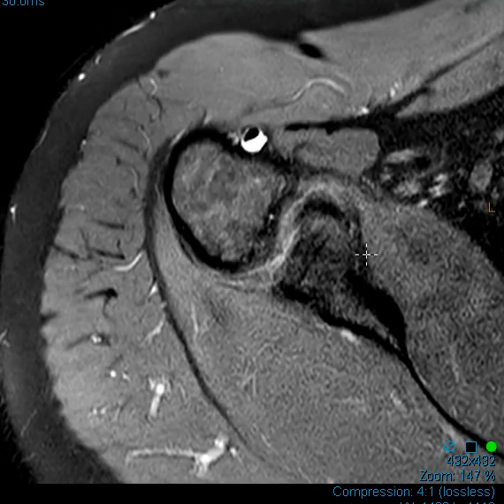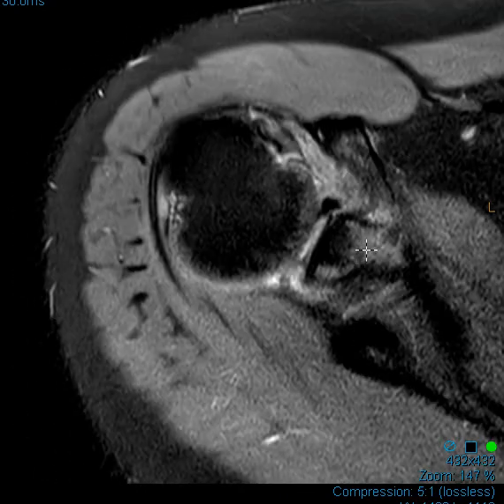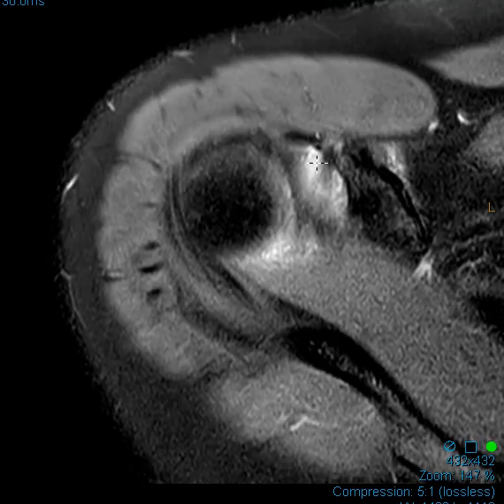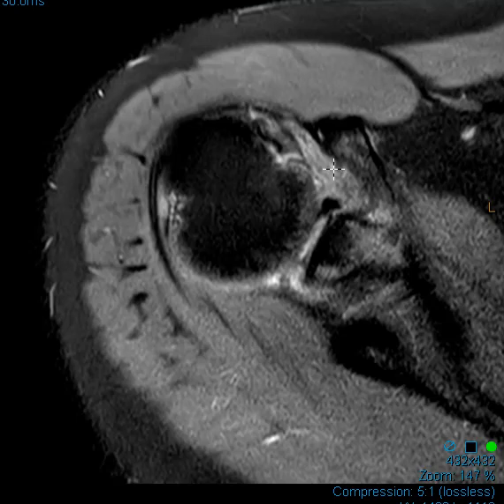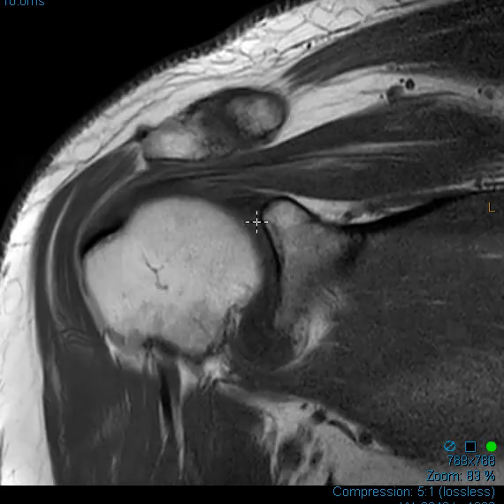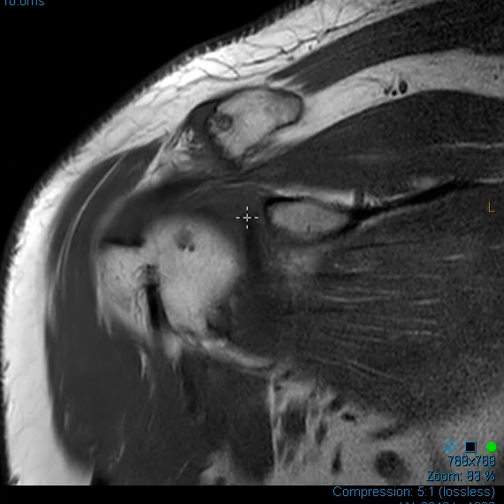The question is, how do we know he has adhesive capsulitis? If we roll up to this region, here's a coracoid process. There's a little area in here that sometimes will get inflammation or scarring. Right in this area, we see intermediate signal like a triangle, in front of the anterior labrum. If we put up a coronal view, we see that area on this view right here.